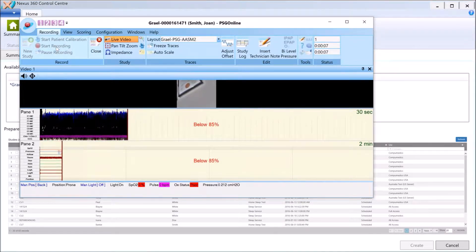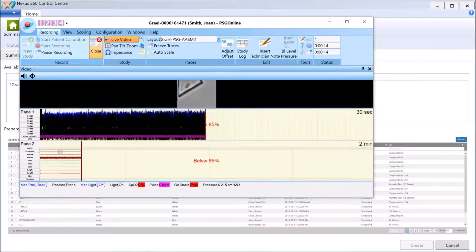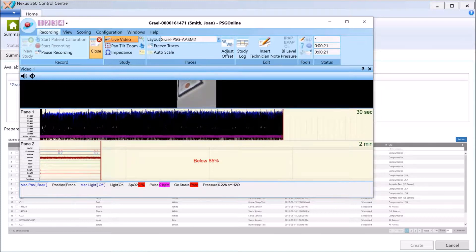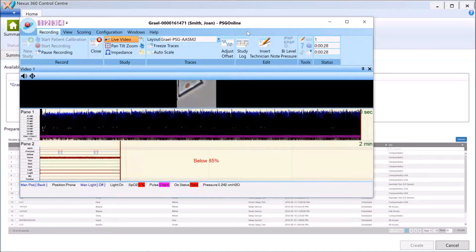I'm going to turn that oximeter warning off now and start recording. PSG Online has now started recording on the acquisition machine. It's important to remember that it's recording a local copy on the acquisition machine — or wherever you choose to put that local copy — and at the same time it's pushing to our cloud server.